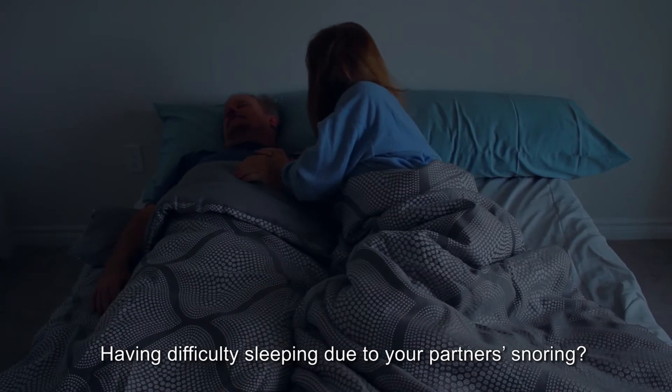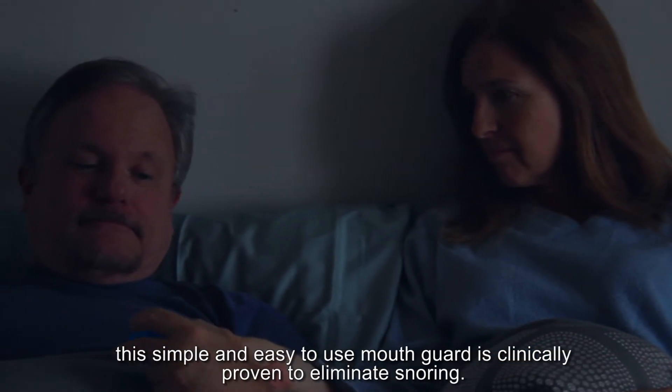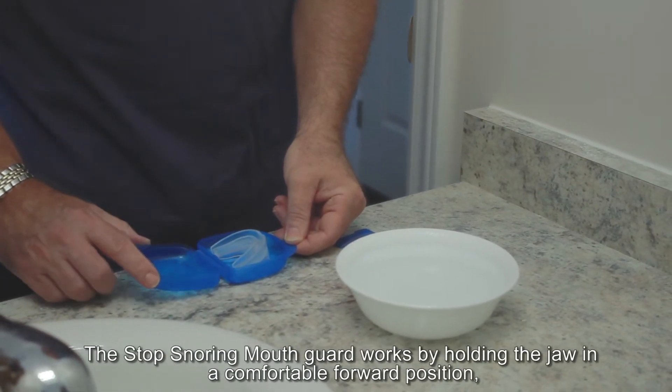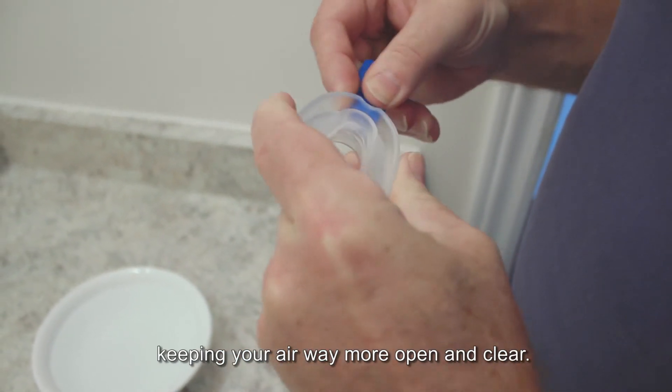Having difficulty sleeping due to your partner's snoring? Introducing the Stop Snoring Mouth Guard. This simple and easy to use mouth guard is clinically proven to eliminate snoring. The Stop Snoring Mouth Guard works by holding the jaw in a comfortable forward position, keeping your airway more open and clear.